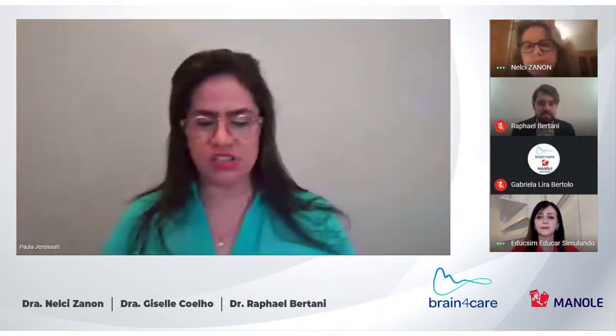Great. Dr. Nelci, just an addendum here. This method now, just to make it clear, we're talking about the brain intracranial compliance, right? Not necessarily about the absolute value of the ICP itself, correct? Yes, and it's just a feeling. It's not proven at the moment. For my thoughts, for my belief, and for my very, very small experience, we are just starting.